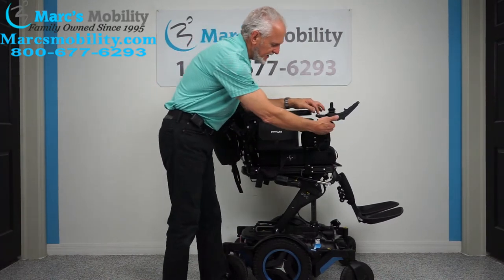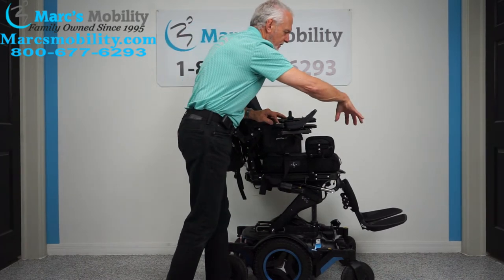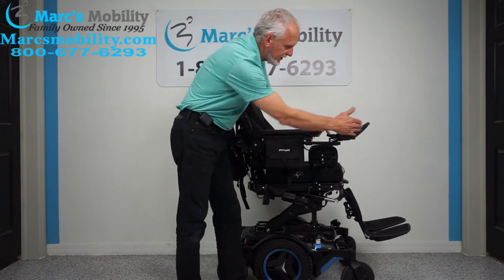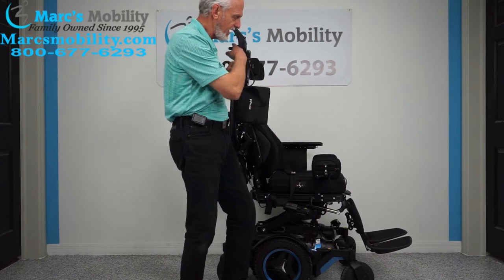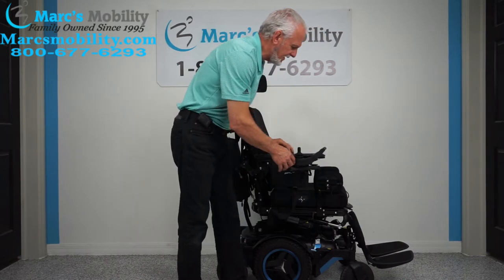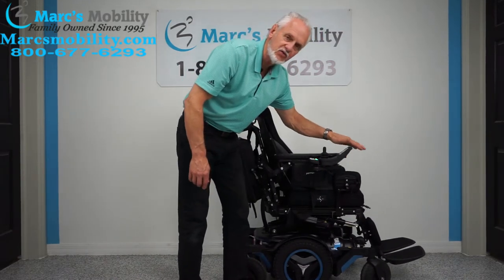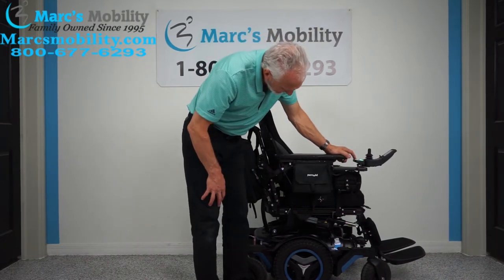As we bring the seat down, let's talk about the swing-away joystick. See how I moved the joystick from here to here? That's called a swing-away joystick. It enables you to get closer to a dining table without awkwardly reaching. With the swing-away joystick, you put it to the side of the arm and drive yourself all the way up to the table. This also saves the joystick from being bumped and damaged.